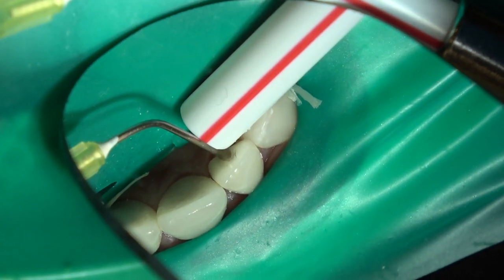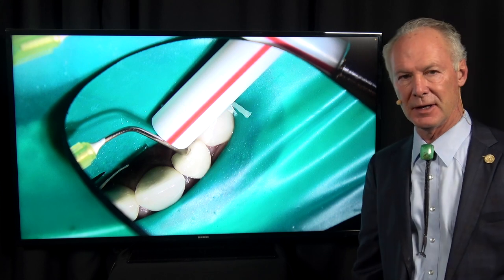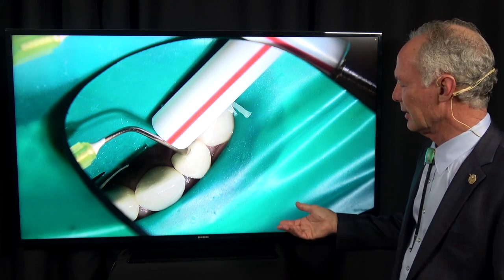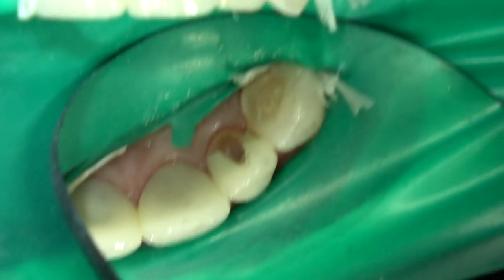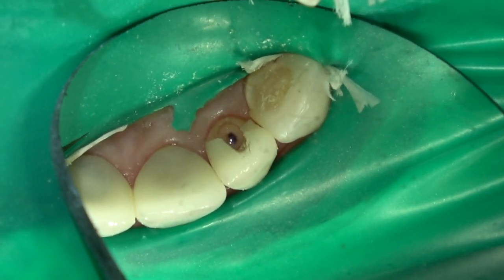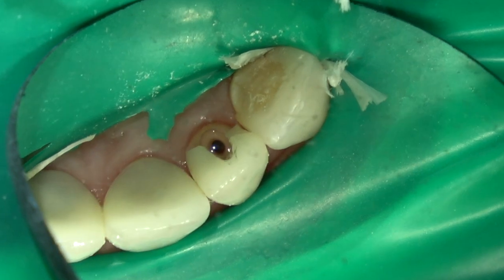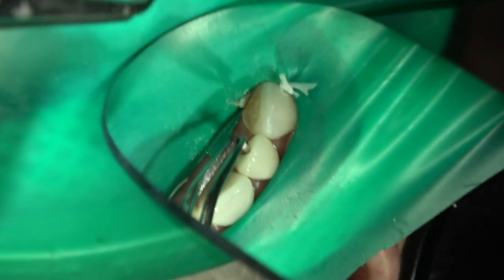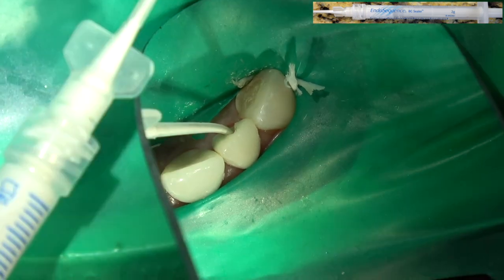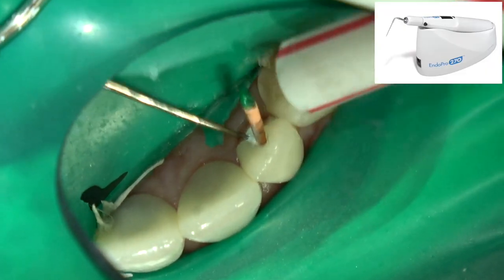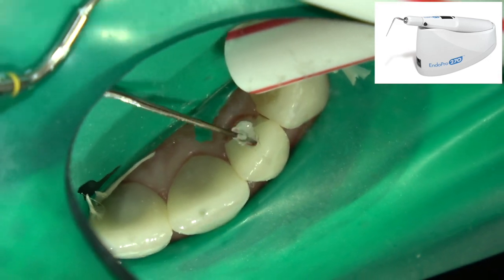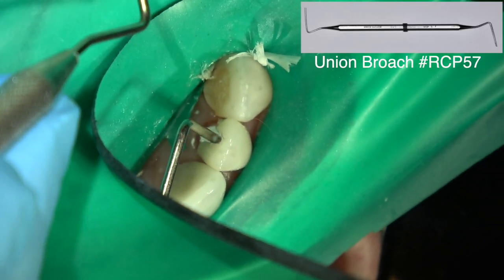This is the gutta-percha cone — you can see it extended past the apical part of the canal, which is what I'd like because I want good drainage through the canal. I'm going to cut the tip of the tooth off and fill it. Here you can see the purulent exudate welling up in that tooth, just pouring out of there. I'll drain it a little while before I fill it — just put the suction right on that orifice and let it drain. I'm going to cut the tip of the tooth off, as I said.